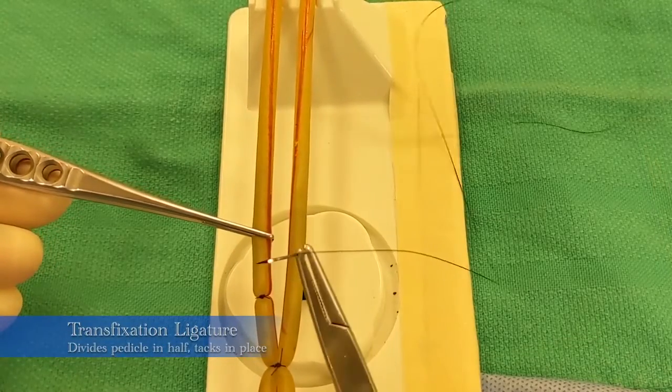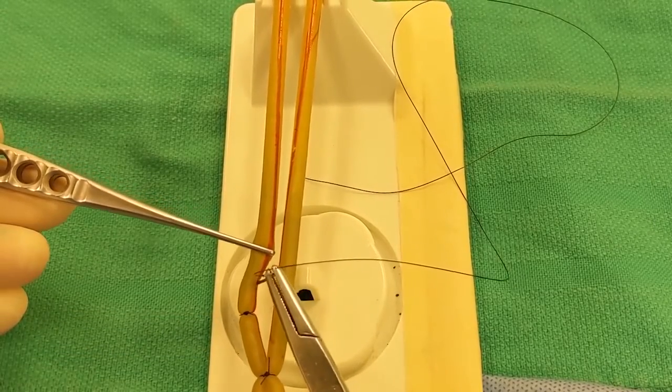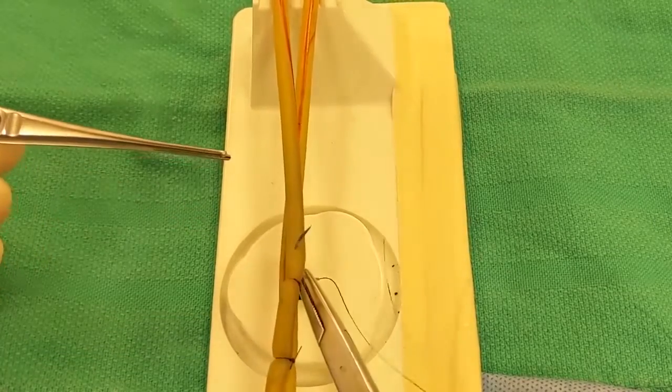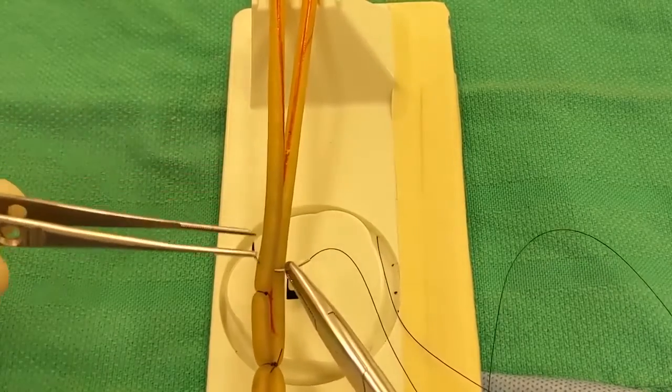Next would be a transfixation ligature. This might be for a larger vessel or maybe a larger pedicle. You actually use the needle to split the vessel or the pedicle in half so that it's divided into two smaller bundles of tissue, which can be ligated separately.